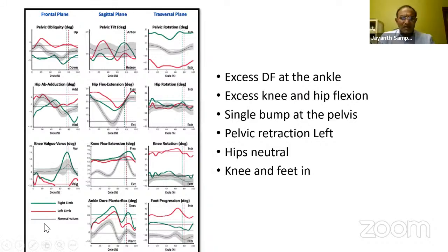So you can see that when there is severe rotation, there are some slight marker placement errors that happen, and these are extremely difficult to control. And the system also has some limits as to how much malrotation or malalignment it can reasonably tolerate.